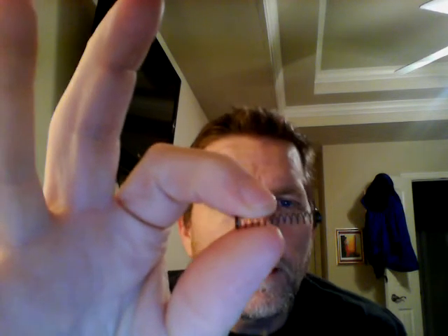But this is very similar to what you would see as a drug-eluting stent. It's very similar in size once deployed and length. The length of the drug-eluting stents could be anywhere between 7 to 28 millimeters, and the diameters will vary just depending on the actual patient and what's needed at that certain time. But it gives you a really good physical visual representation of what a drug-eluting stent might look like.